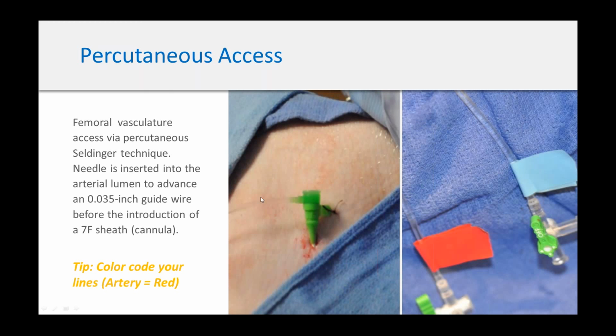And this is what it looks like. So once you can see that there's very minimal trauma here in the pig, we tend to mark the catheters with red for artery, blue for vein if we're in the same place, which we often are. And again, oftentimes ultrasound here will be effective to help finding the vein.